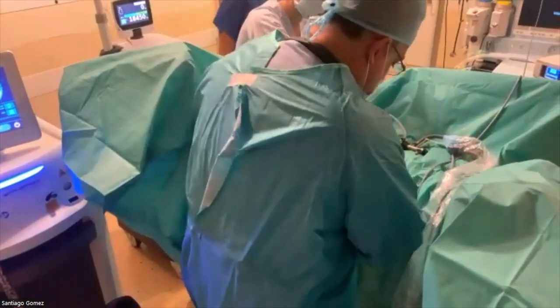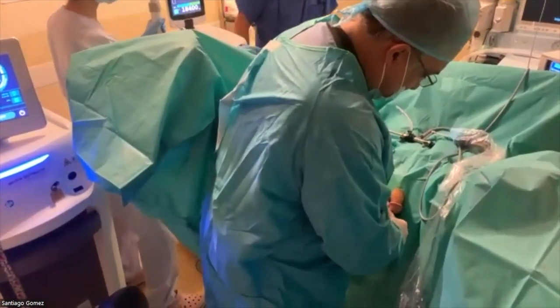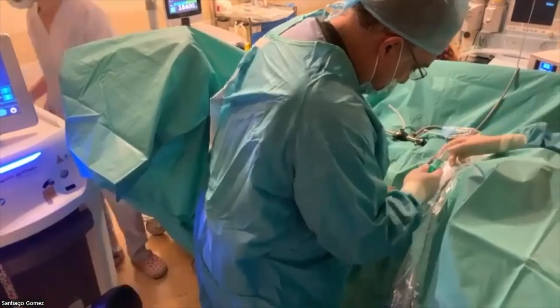Déjame conectar la irrigación. Except in very, very large prostates. This was relatively large.